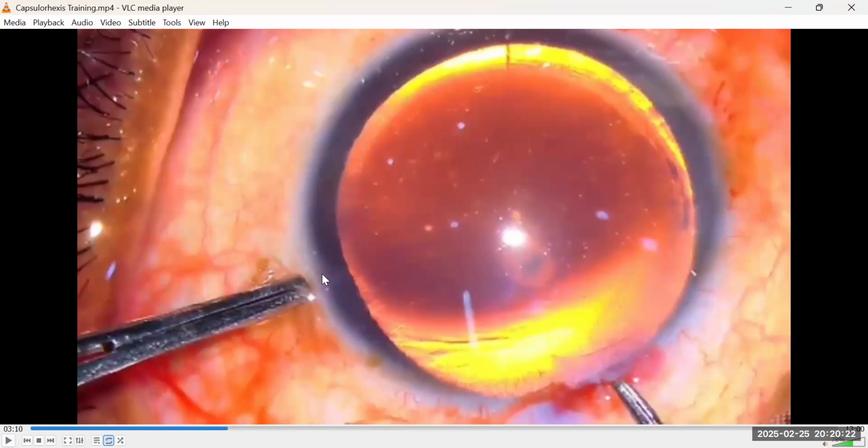So please, score me minus 5 here. Deduct marks here, minus 5. I was fighting the eyeball. I was not doing surgery. Then let me see how I entered and the initial loss and for continued loss. If initial loss, yes. If continued loss, no, stop, please.